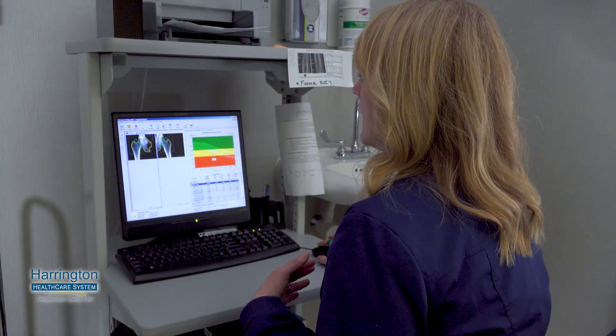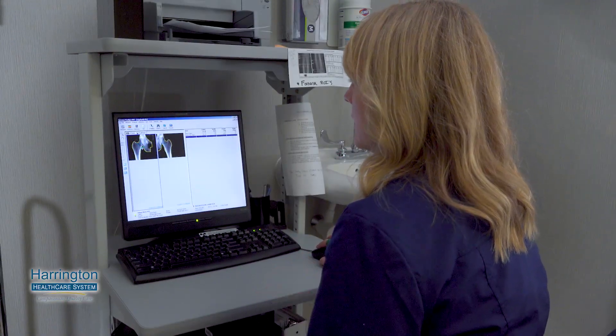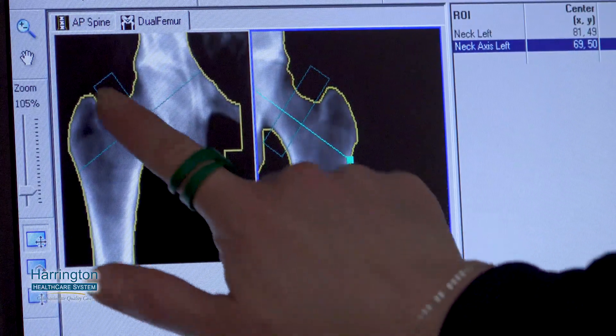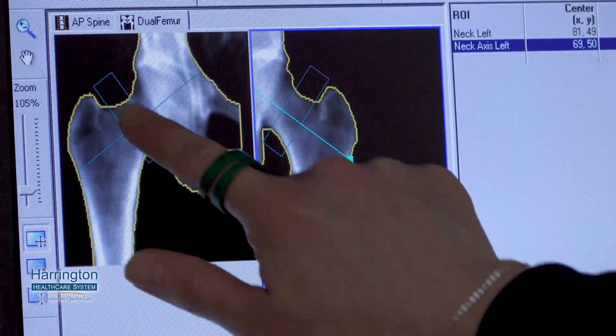We scan their lower back and then both of their hips, and it takes about less than 10 minutes. The technologist that does it stays in the room. It's not like a regular x-ray where you have to leave the room — it's such a small amount of x-ray coming out that we can sit right next to it. As long as I'm three feet away, we're good.